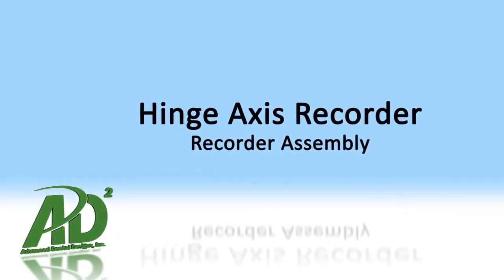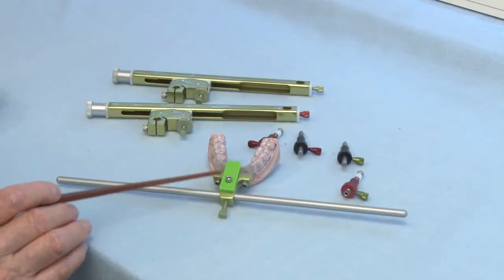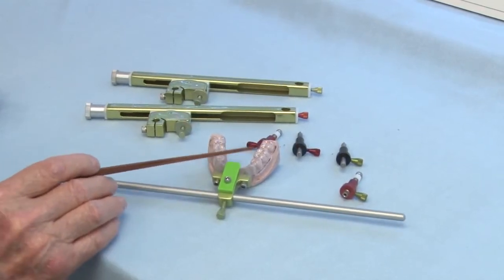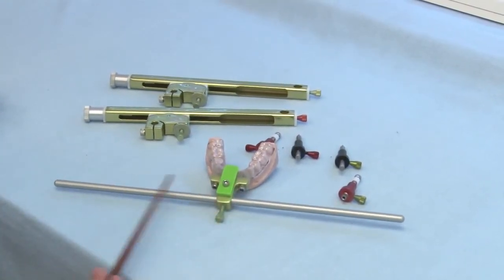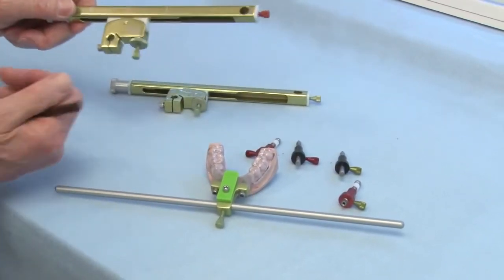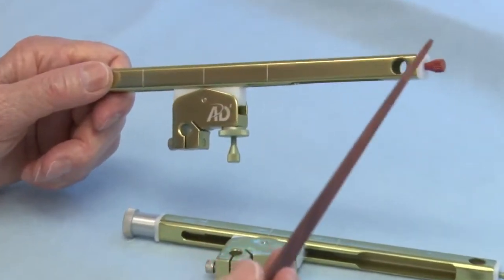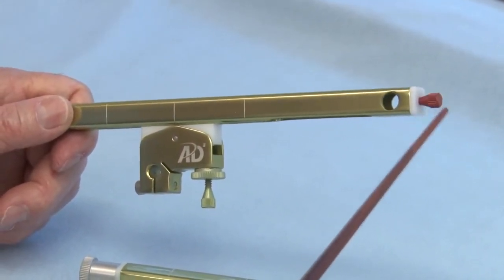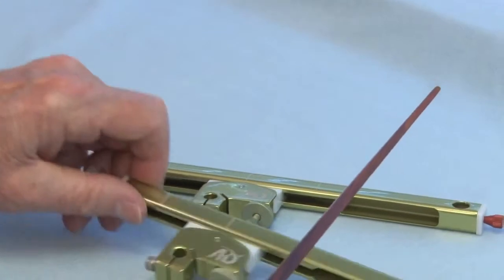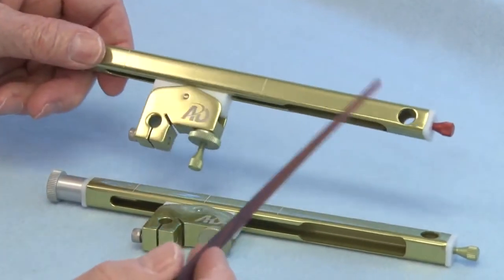Let me demonstrate to you how the side arms work, and we're going to pretend that this is the actual patient's lower jaw here, with the clutch seated on the patient's lower teeth and the crossbar in place. But first, let's look at the side arms. This side arm is for the right side. You can see the red indicates right, green indicates left. So we have a right and left side arm.